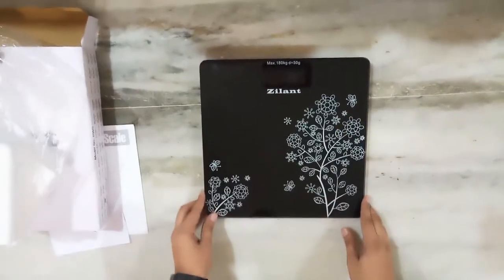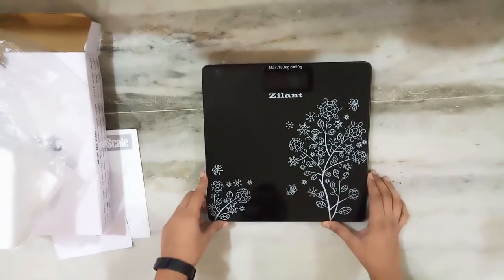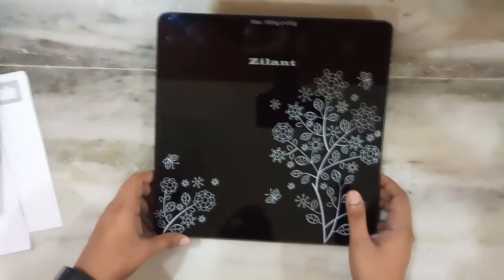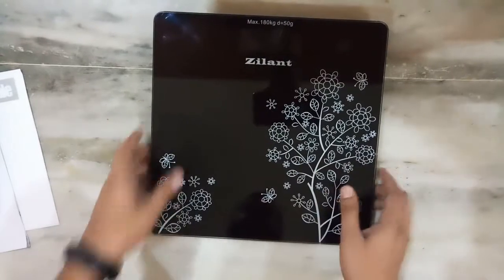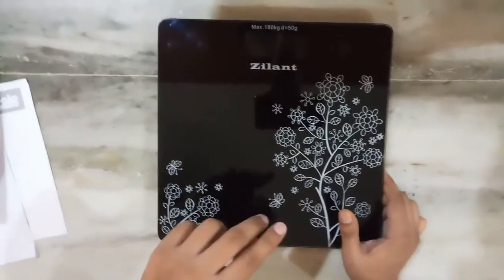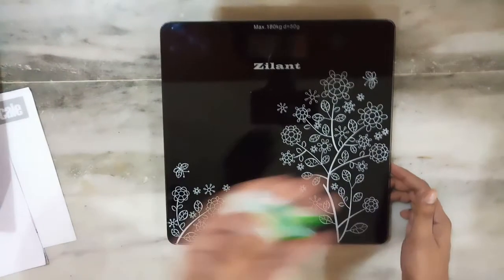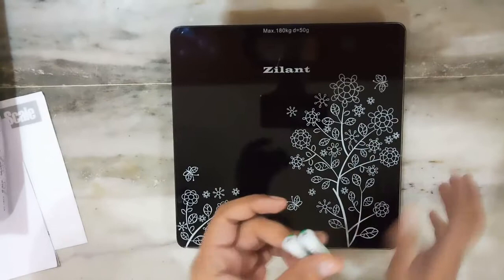So here is the scale. The scale is very good looking. The scale needs two batteries. Two batteries were provided with the scale but those are dead actually — I tried and checked, so I just threw them away. I have two old batteries and I just used them.